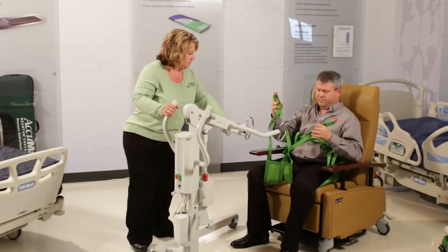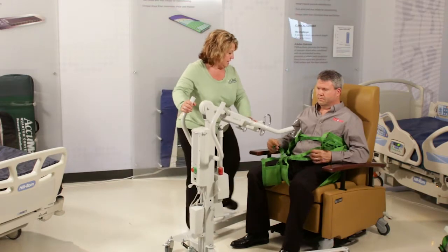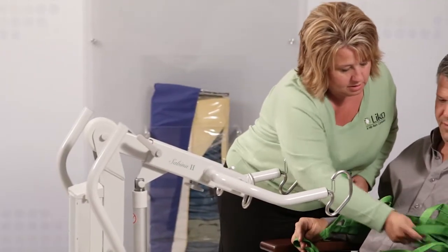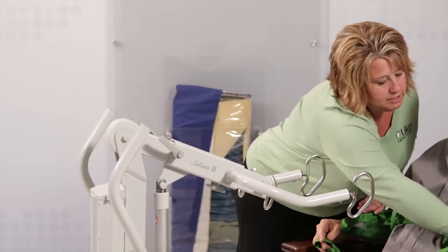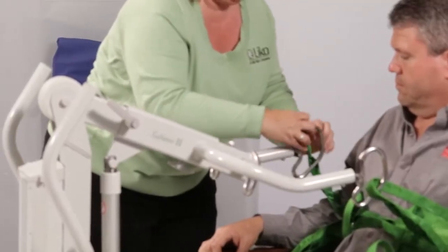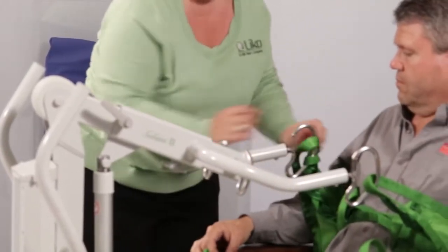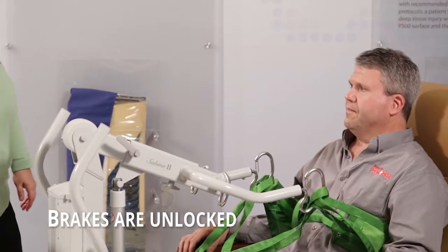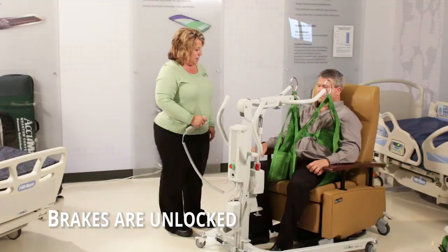We're going to slide the lift in and hook the head part up first — same as a standard vertical lift. There you go. Part of your legs. You let it find its center of gravity again.